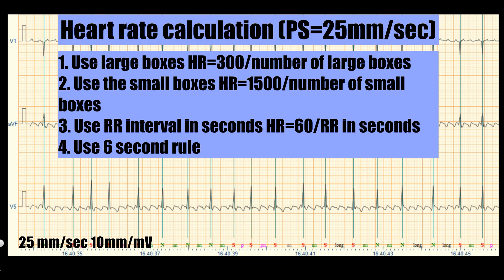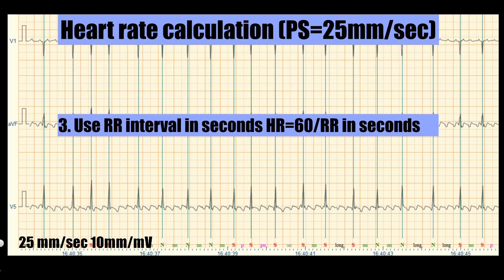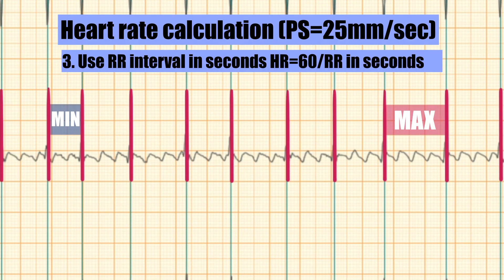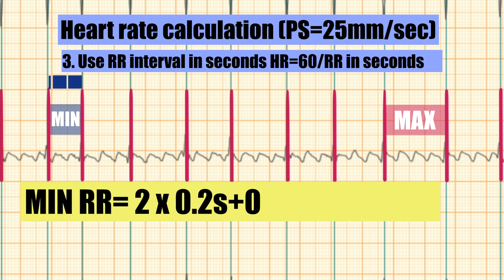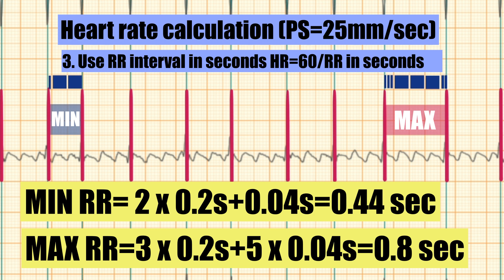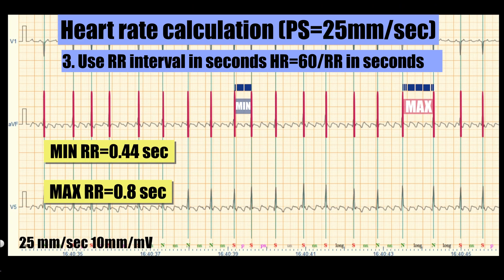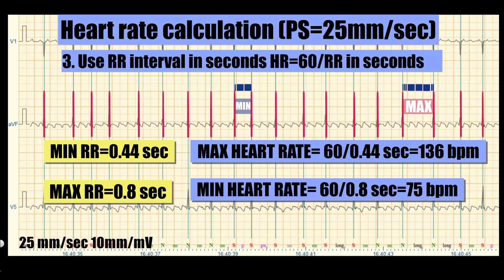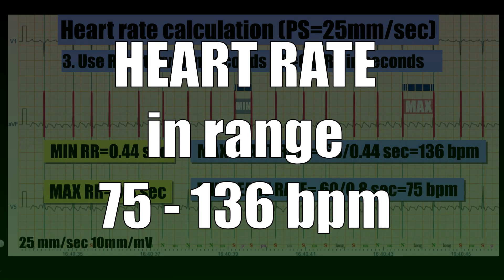I prefer calculating heart rate from both the smallest and largest RR intervals, which gives more information. Using the formula 60 divided by RR interval in seconds: the minimal RR interval is 0.44 seconds and the maximal is 0.80 seconds. This gives heart rates of 136 and 75 beats per minute respectively, so the heart rate ranges from 75 to 136 beats per minute, describing how irregular this rhythm is.